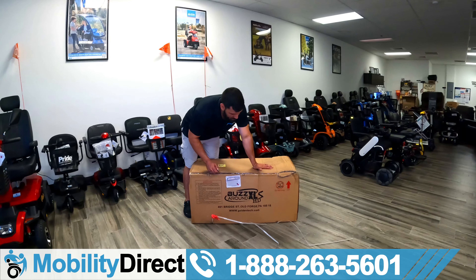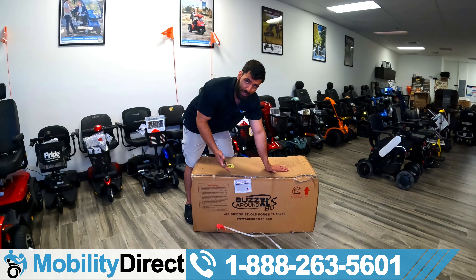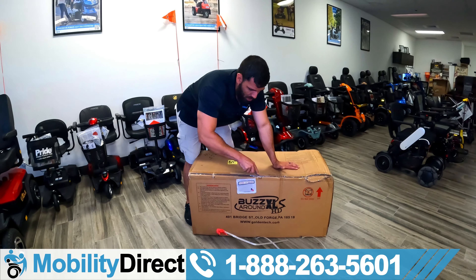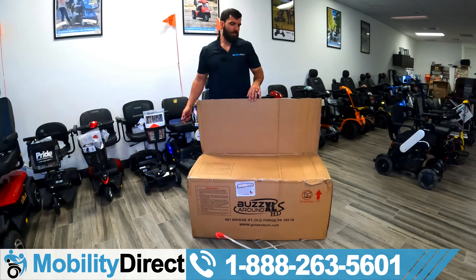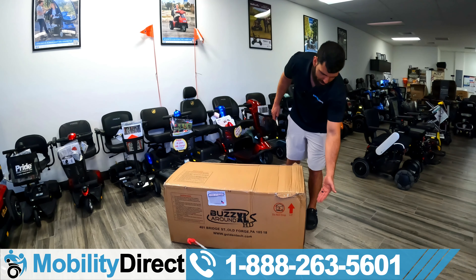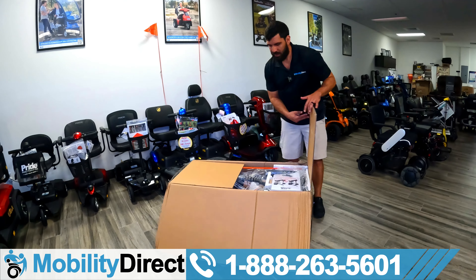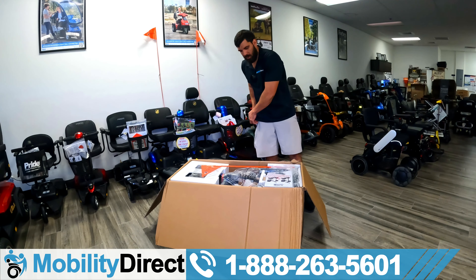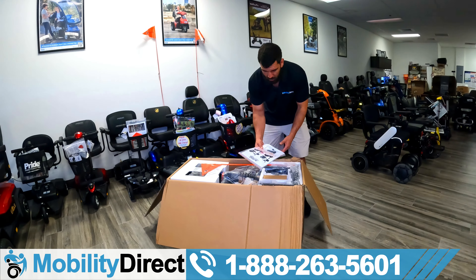You're going to want to pay attention to the integrity of the box. If it's completely crushed and it looks like your product's probably damaged, it's perfectly okay to refuse the delivery. Take pictures and contact our customer service department right away. In this case, the corners are dinged up, but that's normal. Golden Technologies really does a good job at packaging their products, so little dings in the corners are normal — you don't need to refuse the delivery because 99% of the time the product's going to be fine. There's a ton of styrofoam and bubble wrap, so everything is really well protected. But extreme damage is another story, and it's totally okay to refuse the order if you see an extreme amount of damage.